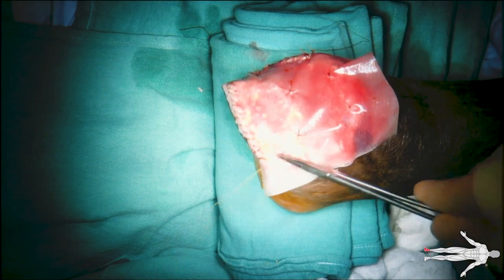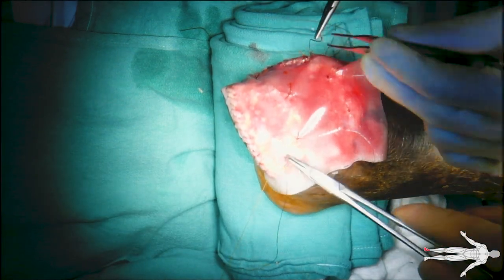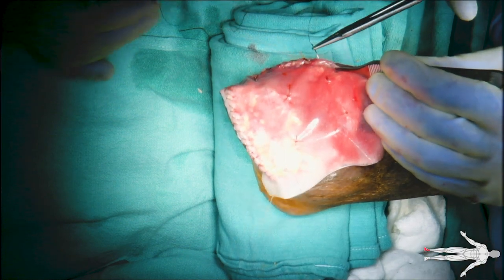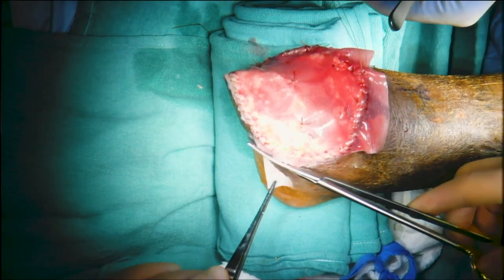The edges of the Integra are sutured to the wound using absorbable 4-0 chromic sutures in a running fashion per surgeon preference. Care is taken to suture ship to shore, or from graft to wound, as seen in the near field. This is to ensure greater control with graft inset as the suture is being pulled through a fixed point. Excess Integra is trimmed off the wound edges.